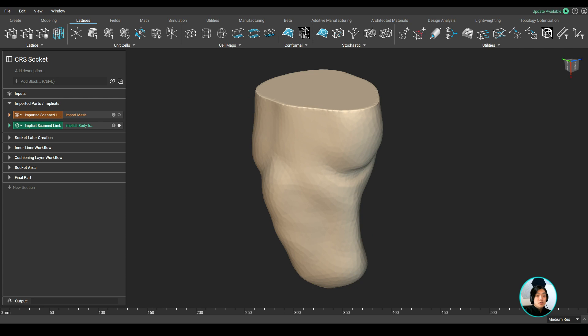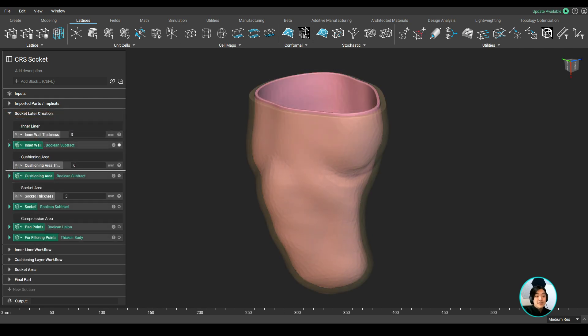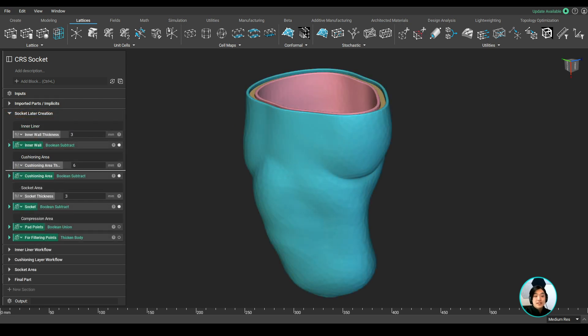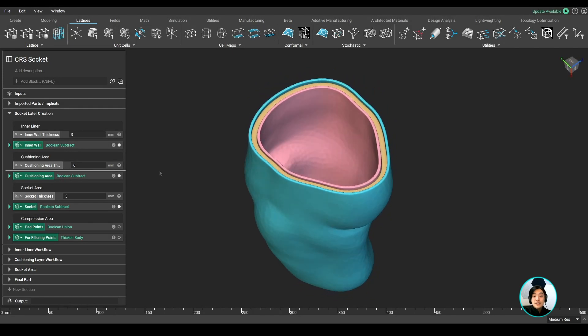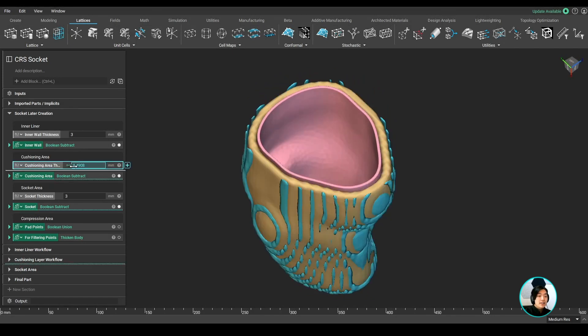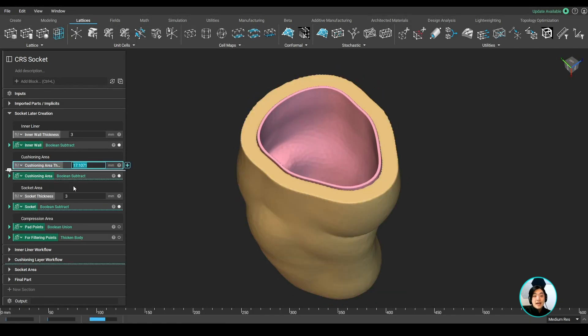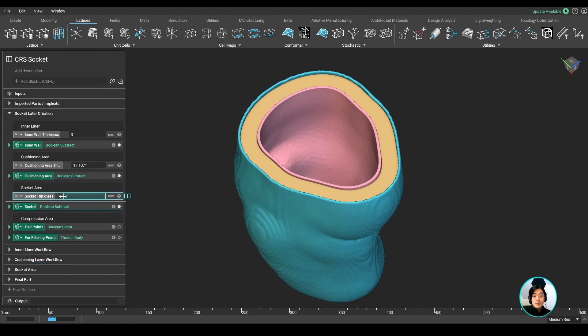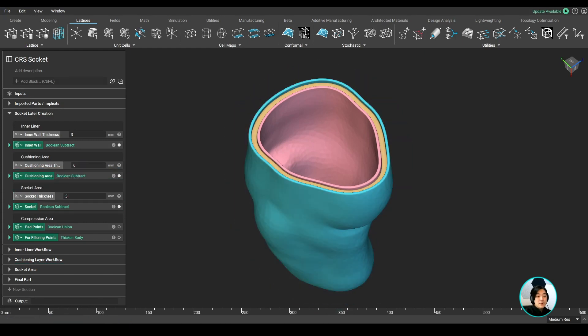I used a simple shell operation to generate my layers and a couple of boolean operations to clean it up. I also pulled out the thickness parameter for each layer so I could easily change each layer's thickness at any point during my workflow. Once I'm satisfied with my result, I can start working on them individually.